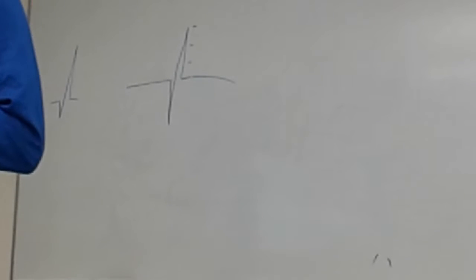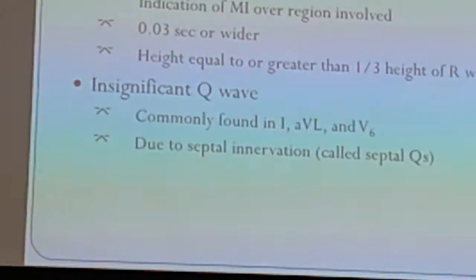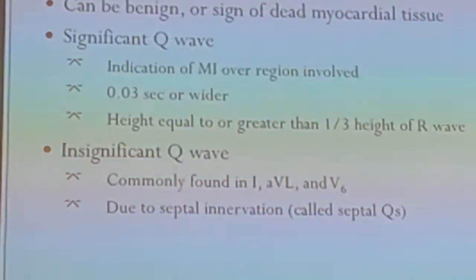Regardless of the camera view. Although some cameras show Q waves and some typically don't. Correct. But if you see one in those cameras that don't normally show it, it's because it's going to be pathologic almost always. Otherwise, it wouldn't be there. So we don't know that yet. No, but you will.